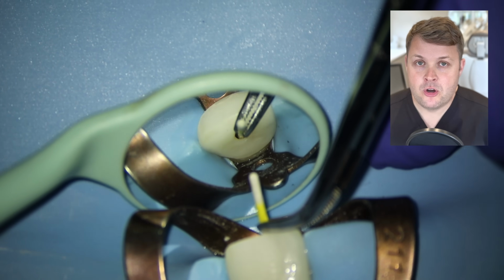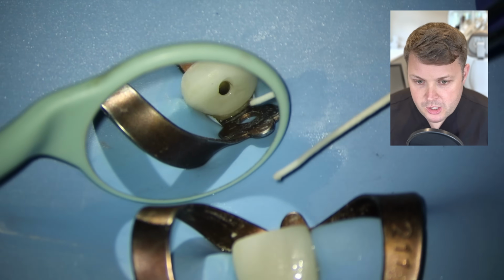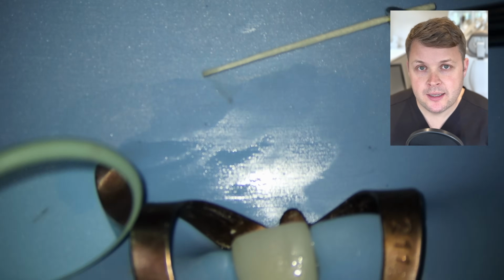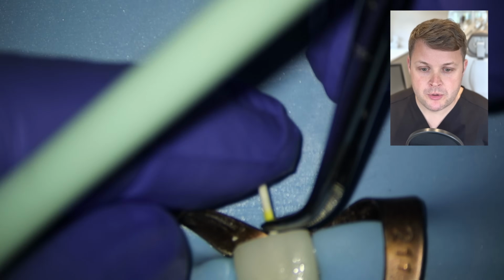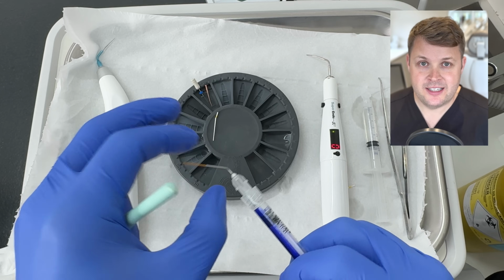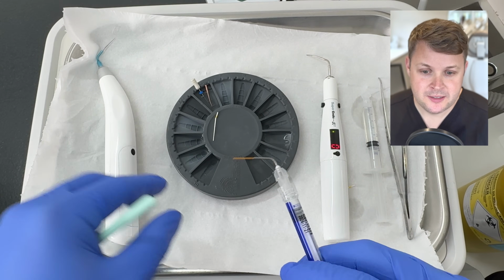And then I've got a more controlled way of making sure that I'm only drying the canal space rather than pushing it through. If you push a paper point through the apex and it touches the tissues, it'll just bleed, okay?